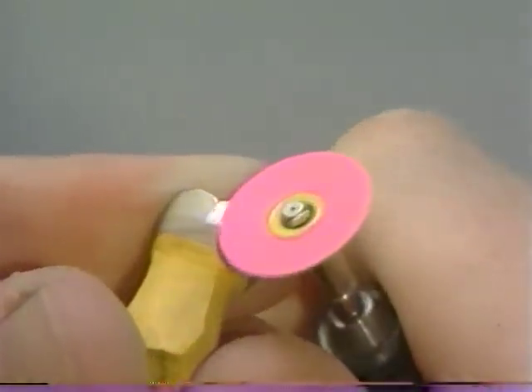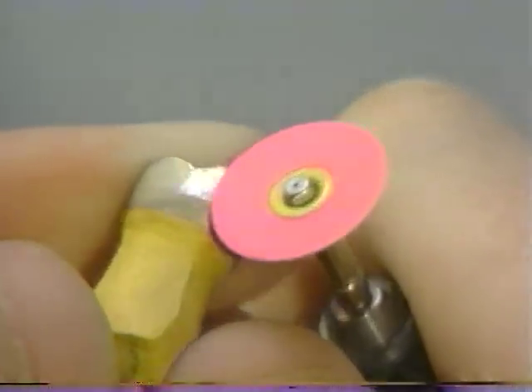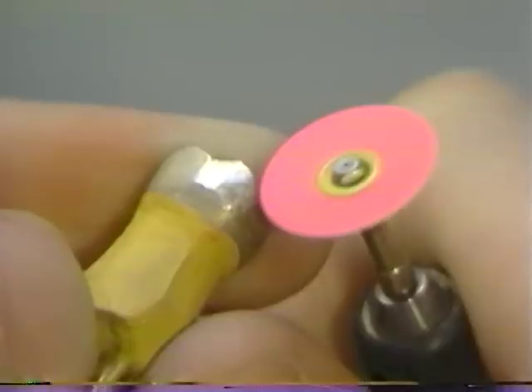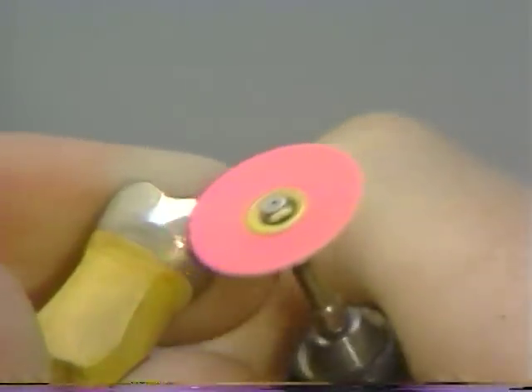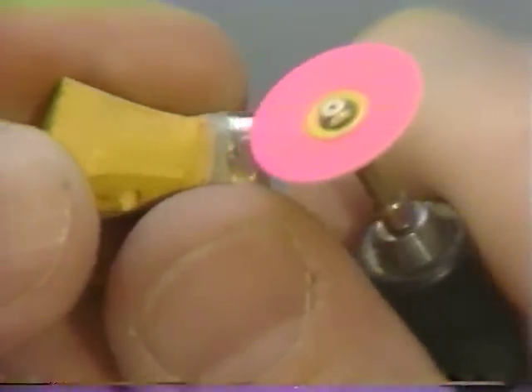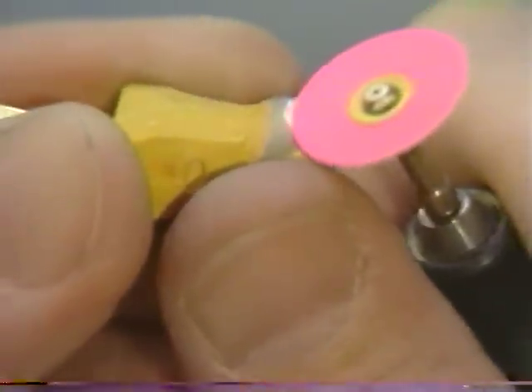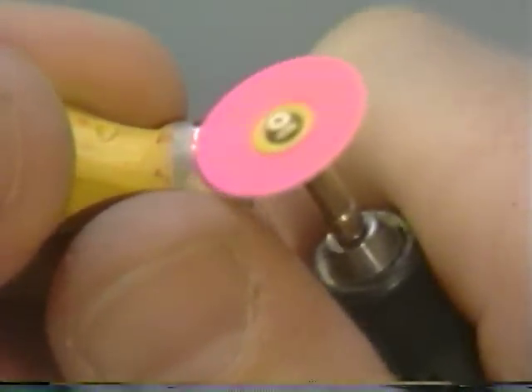A sandpaper disc is used next until a satiny finish is obtained. The key to successful surface finishing is not to switch too rapidly to the next abrasive — each abrasive should be used until it no longer appears to result in any additional smoothing of the surface finish.